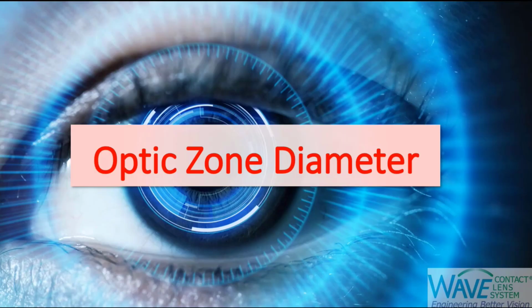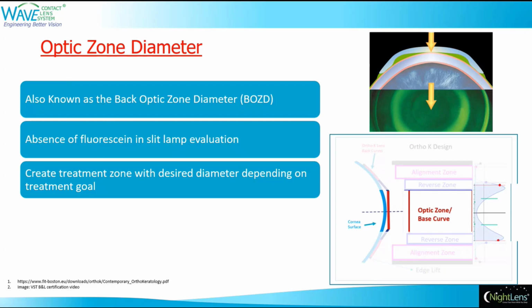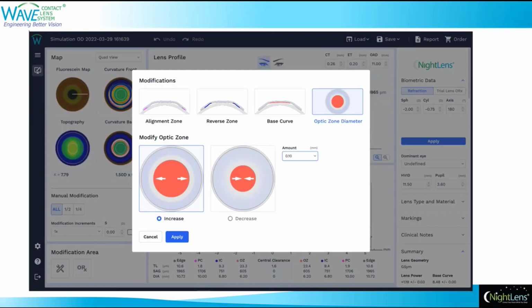Optic zone diameter. So next we are going to talk about the optic zone diameter. This is also known as the back optic zone diameter. This is depicted by the red dot, and it's responsible for the size of the treatment zone, which is seen as the absence of fluorescein on the eye. The purpose of this modification is to create a treatment zone with the desired diameter, depending on your treatment goal, whether it is myopia correction or myopia management.